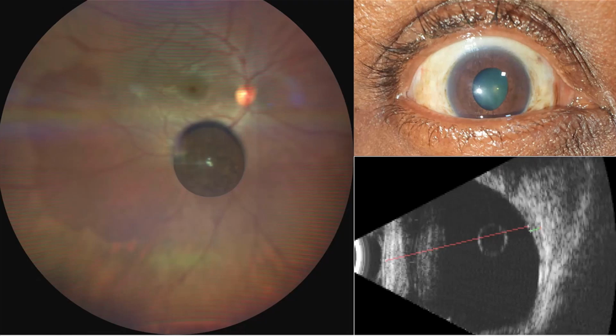Just a guess, anything is fine. So yes, cyst is fine, but what cyst? No, that's why I told you, look at the B scan. I don't know, someone is saying iris cyst. It's a dislocated iris cyst in the vitreous cavity. Okay, it looks like a brown cataract, a dislocated brown cataract, but it's actually a dislocated iris cyst.